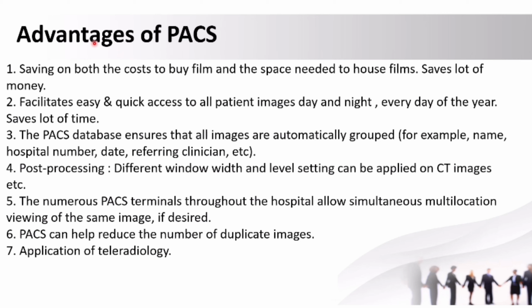Now, what are the advantages of PACS? Mainly, we can save both the cost of buying film and also the space. There is a lot of chance that we can misplace our reports, but if it is computerized and stored somewhere, then we are on the safer side. So it saves a lot of money. Second, it is easy. We can quickly access all patient images anytime, day or night, every day of the year. Saves a lot of time.